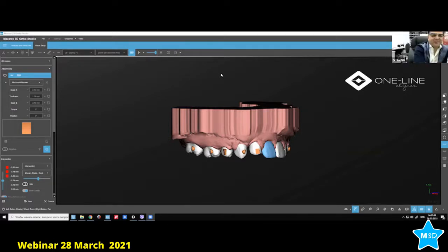So if we think that every case is the same, no. So you need to work on the surface area. You need to see the shape of the tooth. You need to see which simultaneous movement is going to happen, right? Not just one movement. Maybe you're doing rotation with extrusion, like this case as I showed you. So you need to change again. So if somebody who has done 2,000, 3,000 cases sits with the team and we all work together to make it happen, yes, it's possible. Right now, no.